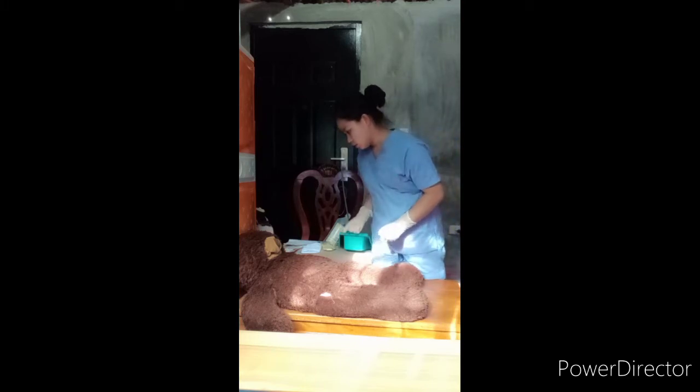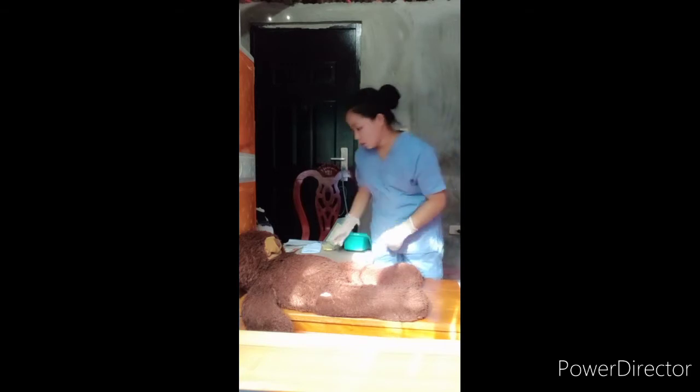Number 5 is let's identify the patients with increased risk of ineffective airway clearance. So, check. Then next is number 6. Let's assess for excessive secretions or coughing, secretions visible in the airway, signs of respiratory distress, and other signs of need for suctioning. Next, number 7 is let's assess patency of the ET tube with capnography or an end-tidal carbon dioxide detector.